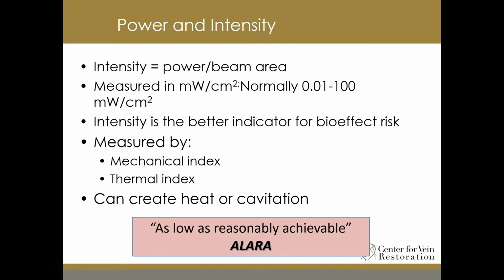Intensity is how much power is concentrated in a particular area and is usually measured against how much time the beam is concentrated in a particular area. Focus and the amount of power will affect the intensity. The AIUM released a statement many years ago stating that there have been no reported bioeffects when the intensity is less than or equal to 100 milliwatts per centimeter squared. A bioeffect is damage or alteration to cells. The bioeffects of ultrasound are heat and cavitation.